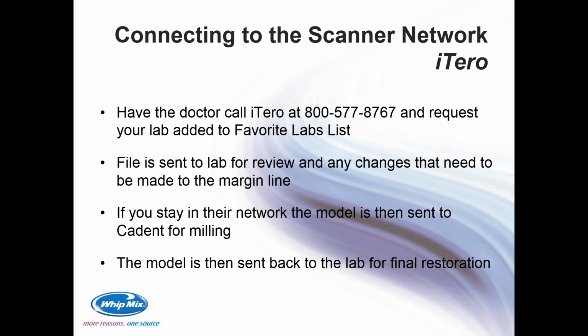You can make changes to the margin line at that point in time. If you were to stay within the iTero network, you would then have that file, that digital impression that has been changed by you, or if any changes were needed to be made by you, then goes to Cadent to be milled. They mill their models, and then at that point in time, the model is sent back to your lab for final restoration.